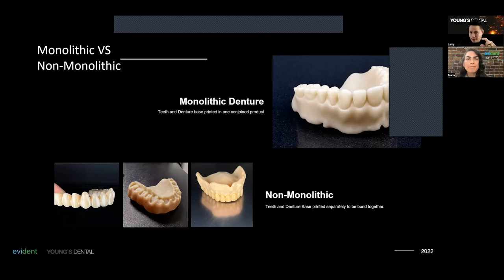And sometimes you have to angle it in a certain way in your CAM software to make sure it fits right and reduces undercut, et cetera. It might not fit. So 3D printing has an advantage where it doesn't matter how tall it is, it will still print, right? But with milling, beyond 30 millimeters, you're going to have problems. You would have to mill individual teeth separately and the base separately. So I want everyone to understand when they think about milled dentures versus 3D printing dentures, those are the parameters in the milling world. Okay.